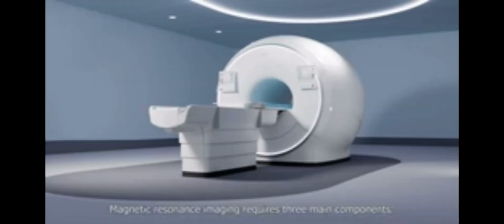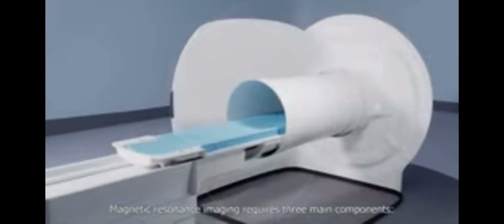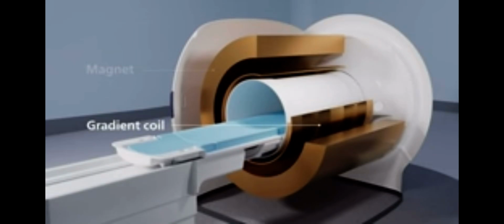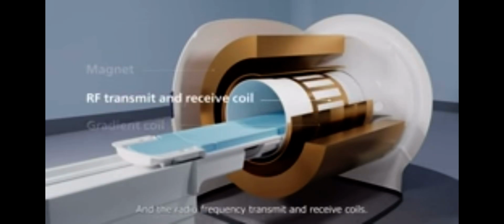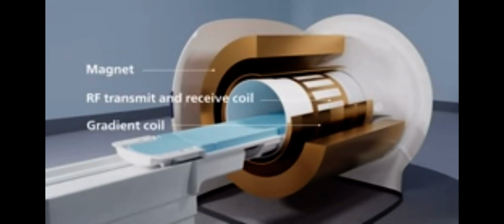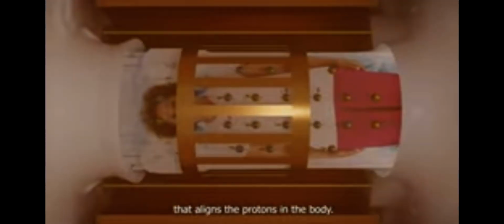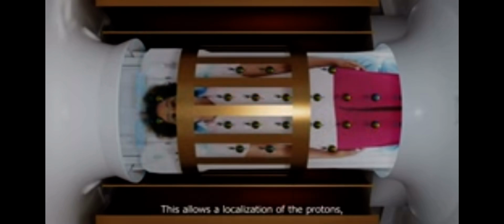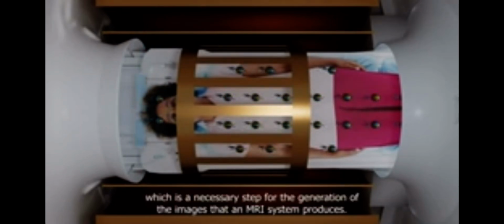Magnetic resonance imaging requires three main components: the magnet, the gradient coils, and the radio frequency transmit and receive coils. The magnet creates a very strong magnetic field that aligns the protons in the body. The gradient coils change the magnetic field in three planes so that the targeted protons have a different vibration frequency from their surroundings. This allows localization of the protons, which is a necessary step for the generation of the images that an MRI system produces.